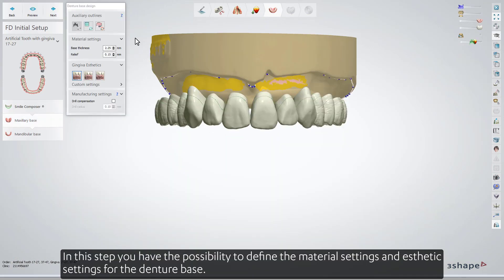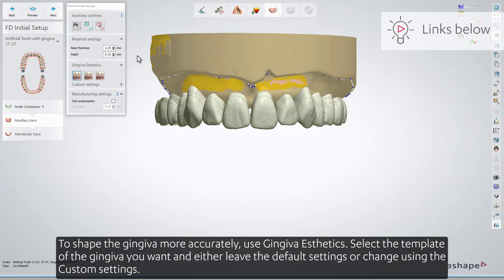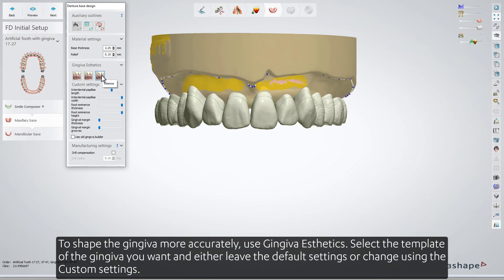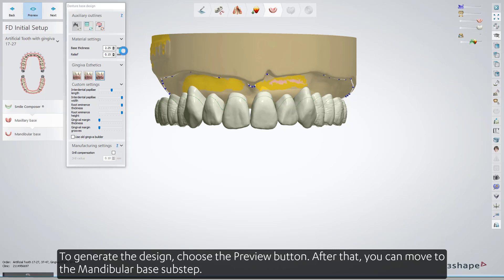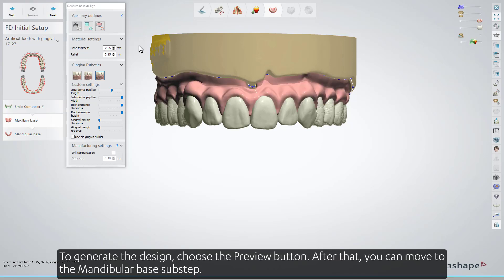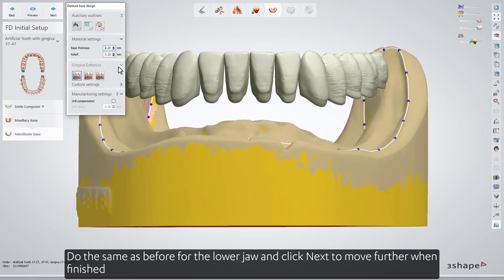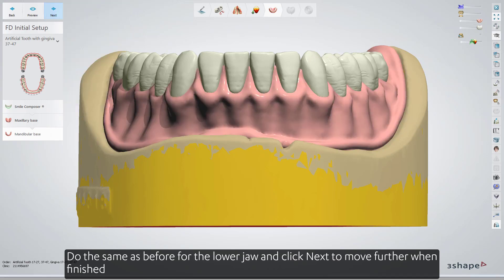In this step, you have the possibility to define the material settings and aesthetic settings for the denture base. To shape the gingiva more accurately, use gingiva aesthetics. Select the template of the gingiva you want, and either leave the default settings or change using the custom settings. To generate the design, choose the Preview button. After that, you can move to the mandibular base sub-step. Do the same as before for the lower jaw, and click Next to move further when finished.